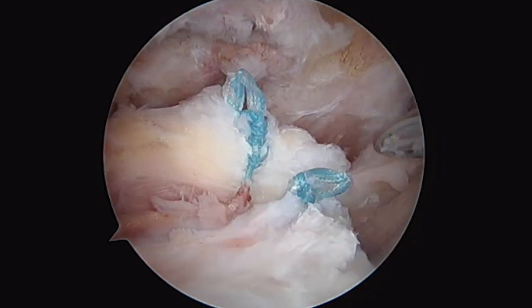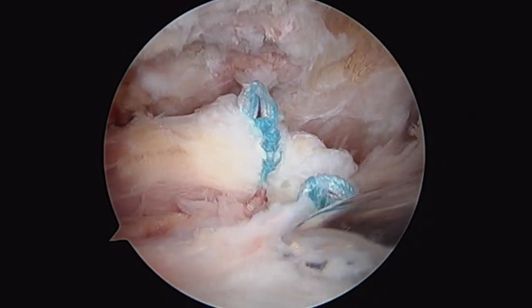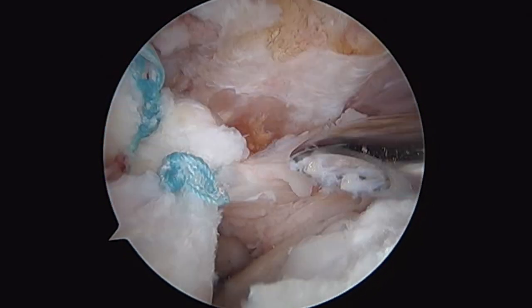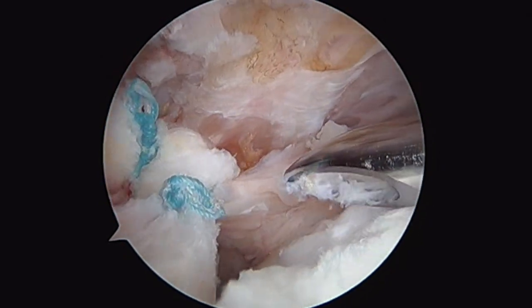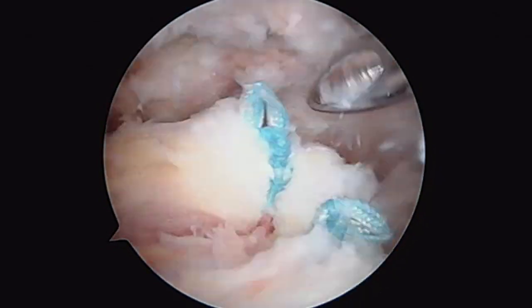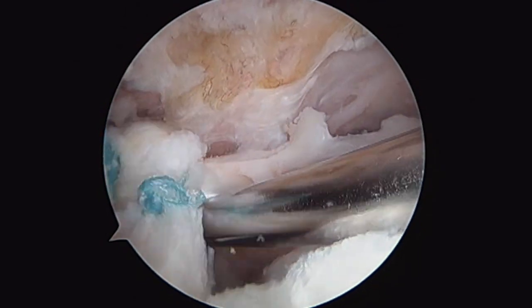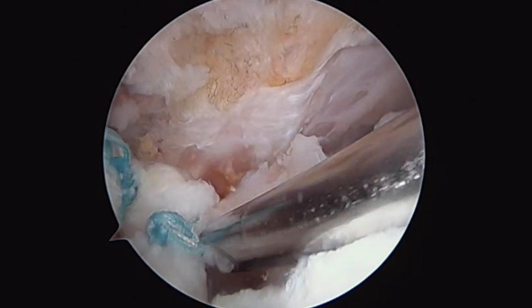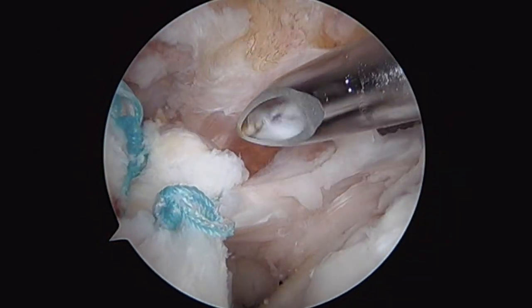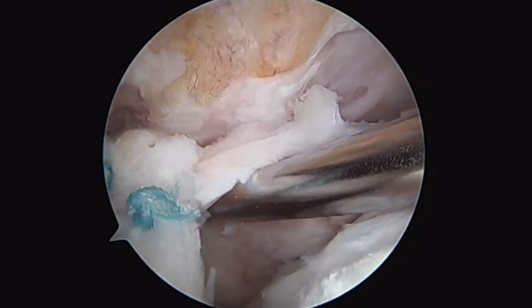Part one is over. I used two sutures to re-approximate the two sides. I brought the anterior cuff over to meet some of the posterior cuff tissue. Now the tear looks a little bit more manageable. I call this the torpedo, which is good because what's really important for these tears is to release the tissue, because oftentimes adhesions are formed between the cuff and the underlying bone. This torpedo-shaped shaver allows me to get in under it and perform my releases of this cuff tissue.